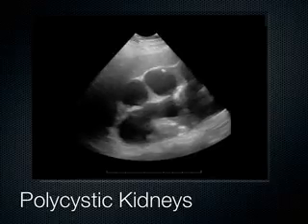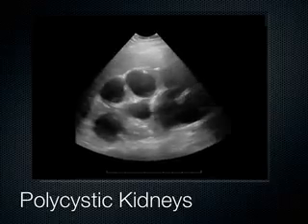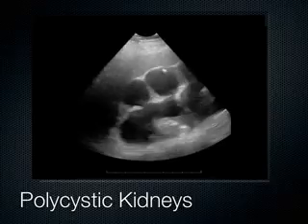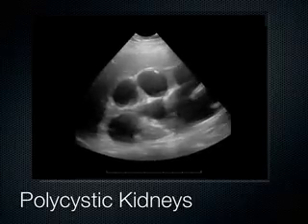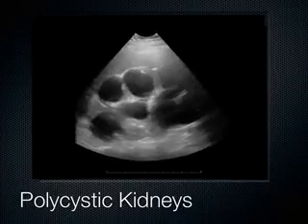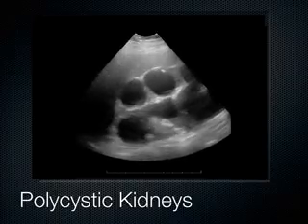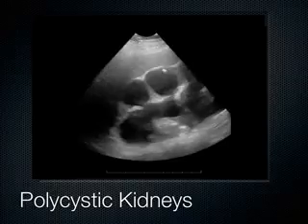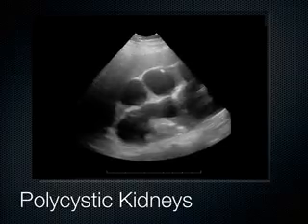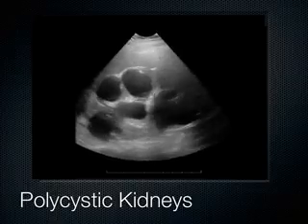You heard of polycystic kidney disease? This is what it looks like on ultrasound. These are all these cysts seen out here in the cortex. We can make that one here, this one here, this one here, this one down here. Polycystic kidneys, and it's bilateral. And you can see it also affect other organs. Sometimes you can see cysts in the spleen. You see them around the liver. Ovaries look like this when they're polycystic disease.